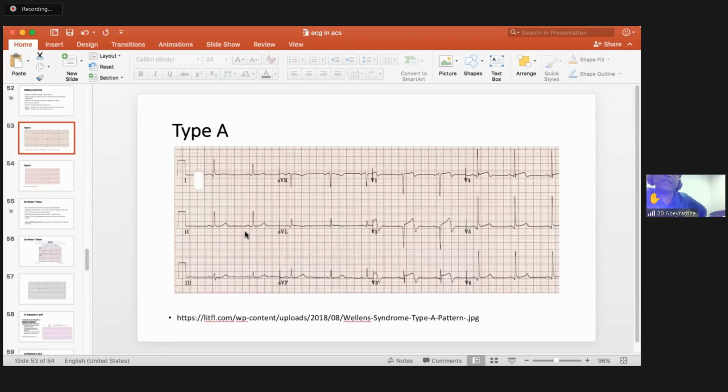There have been several times I heard the J point in ECG. Madam, precisely what is the J point? In the ECG, you mentioned several times that J point. Precisely, what is the J point?